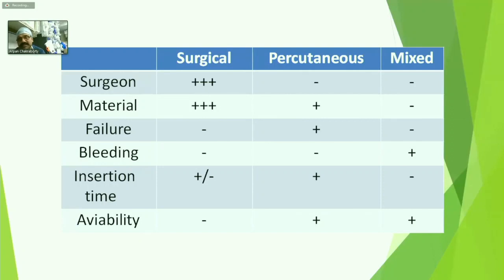A person who is not regularly doing central cannulation should not attempt the central cannulation at that point of time. And the surgeon who is very fine in doing central cannulation, very fast, should not attempt a peripheral cannulation at that point of time, because the thing you are doing regularly, you can perform better at that point of stress.